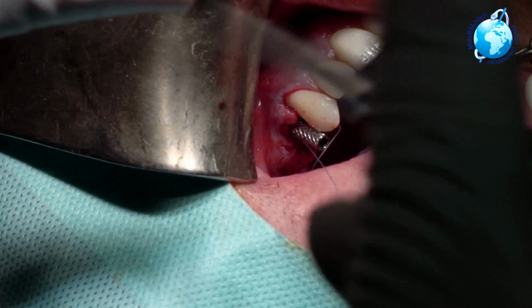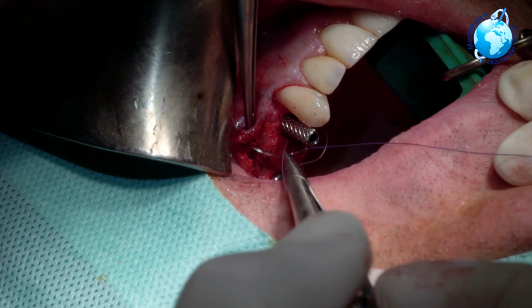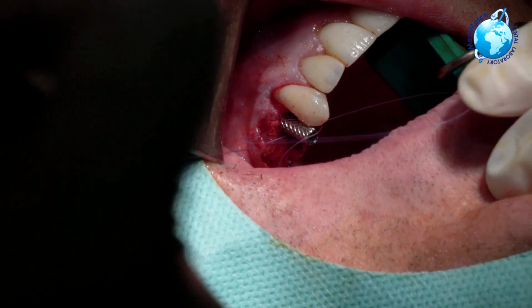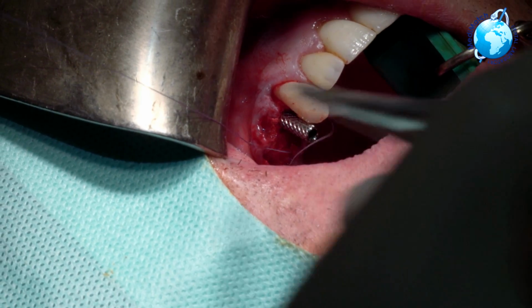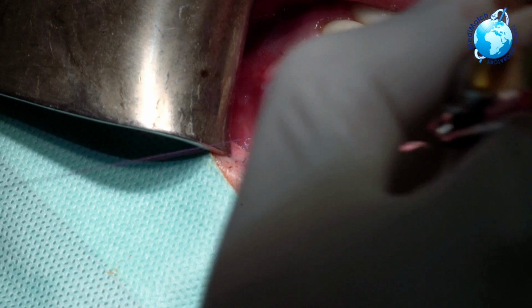Alan's having a nice Scottish snooze. Yeah, okay. One too many lovely beers. You see, I just lost a little bit there. So I'm just going to take that across.